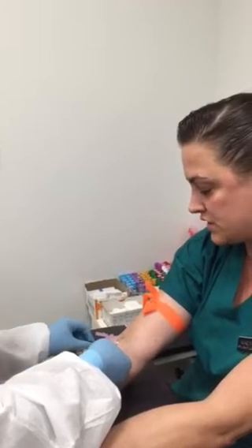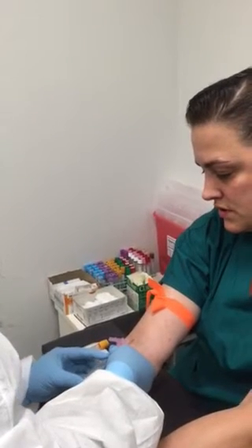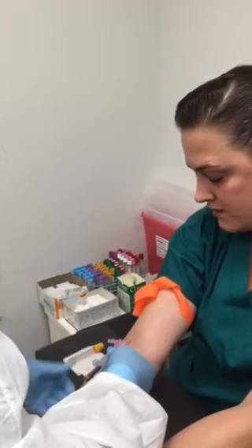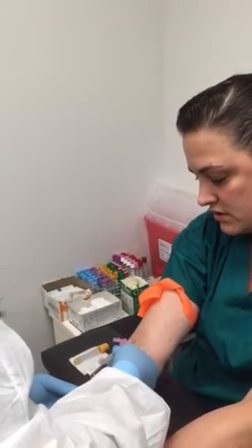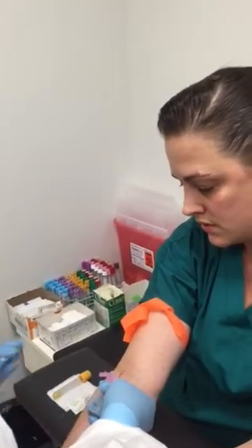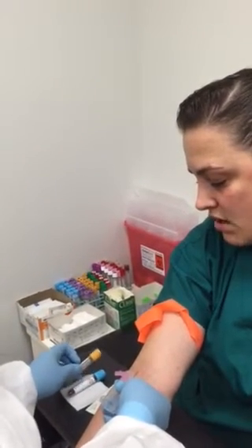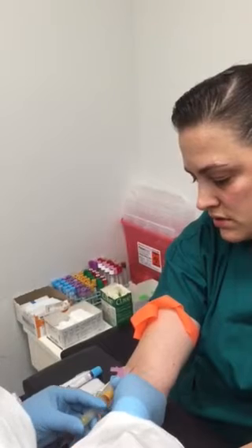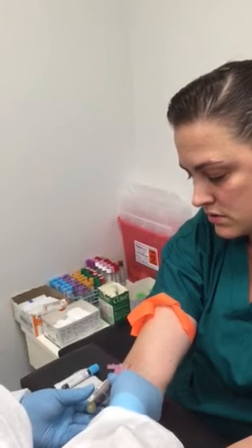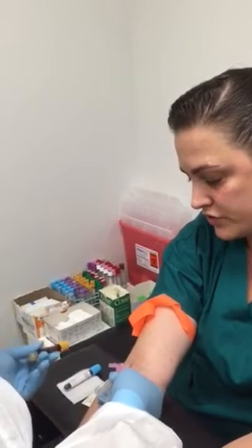Now she's going to make sure she does the blue first because coag always goes first. The patient's going to release her fist, she's going to release the tourniquet, and fill her tubes. Make sure you invert the tubes once they are filled. She's inserting the second one. Invert the tubes.